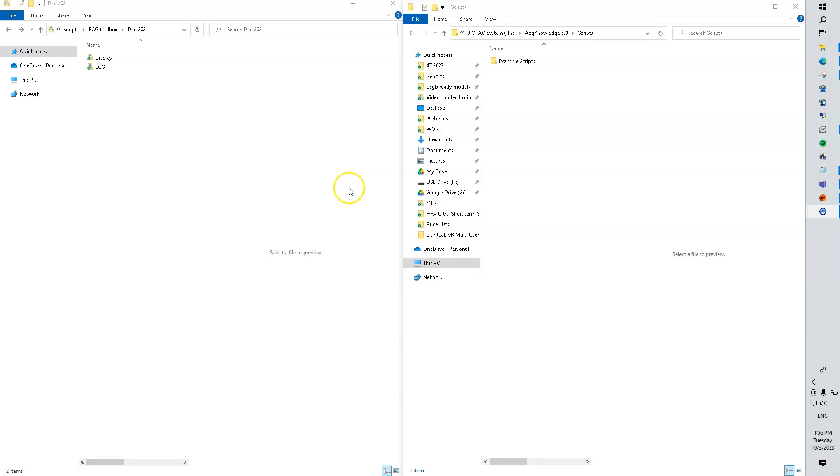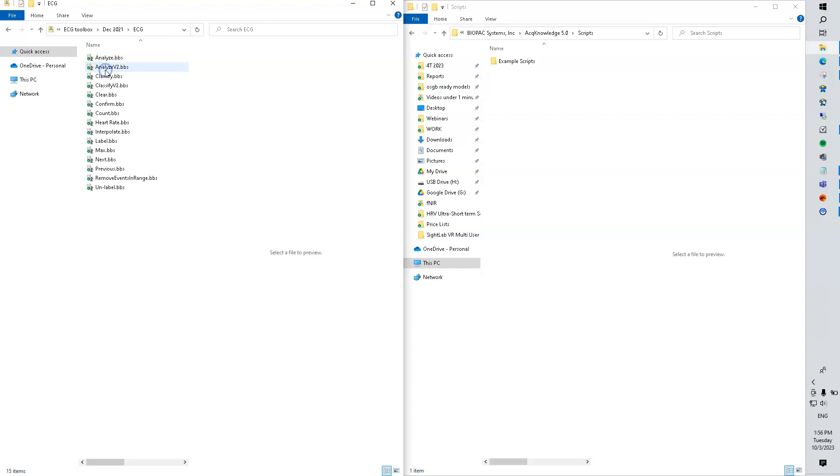This is how we add scripts to the menu in Acknowledge. Notice that the Acknowledge application is not running at the moment. These are the source files of our scripts.